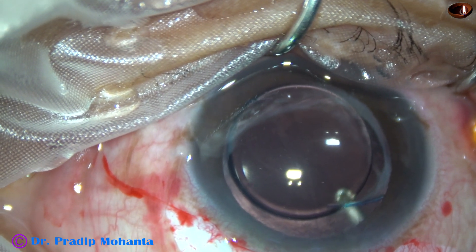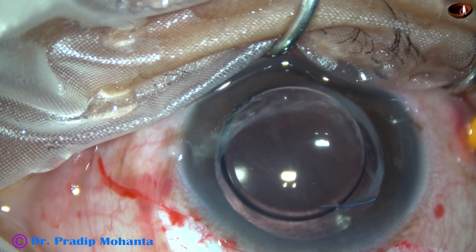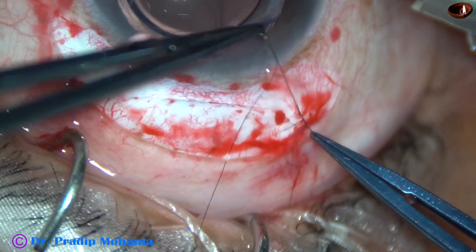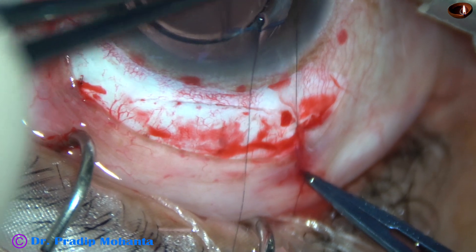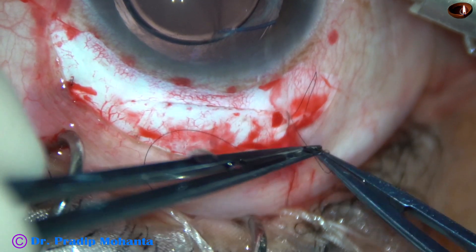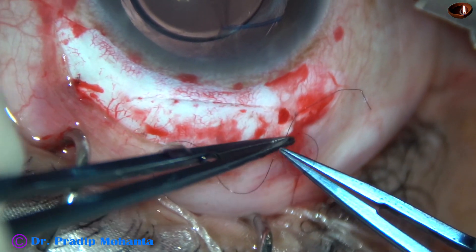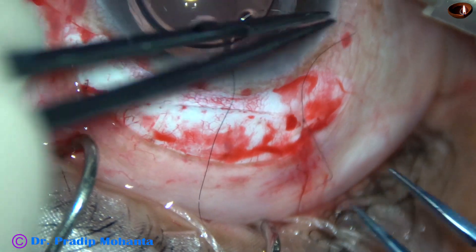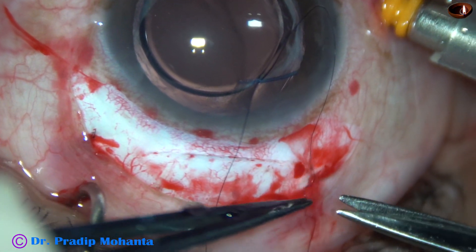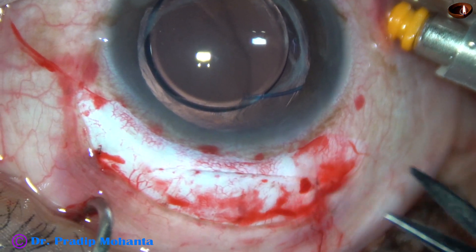Very careful vitrectomy is being done, and now the sclerotomies are closed. This is 10-0 nylon. The best suture is probably 9-0 nylon, better than vicryl sutures.